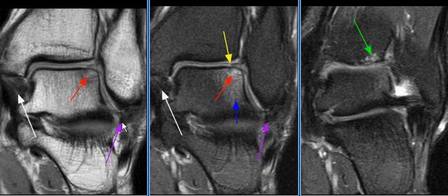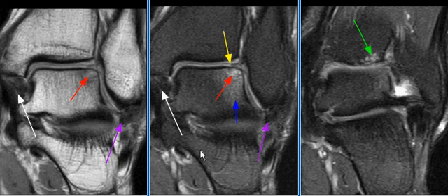There is scarring of the anterior talofibular ligament and calcaneofibular ligament. Also noted is scarring of the deep fibers of the deltoid ligament.